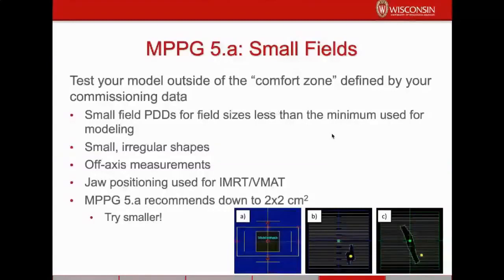So for small fields, I think the most useful piece of advice that I can give you all is that you should test your model outside of the comfort zone defined by your commissioning data.